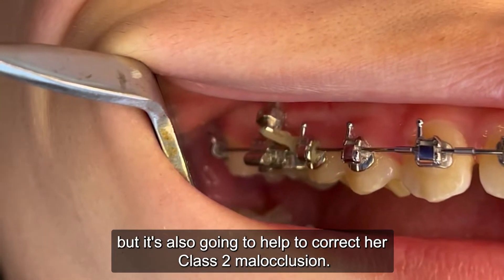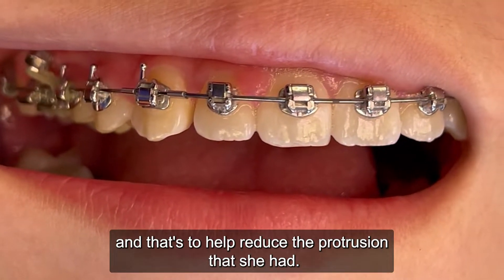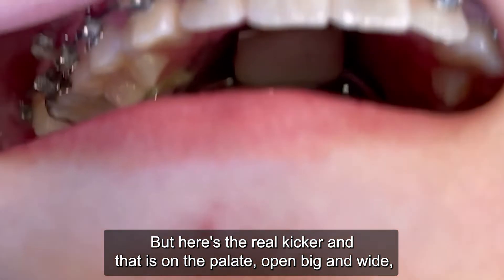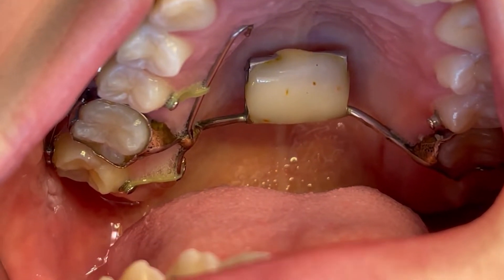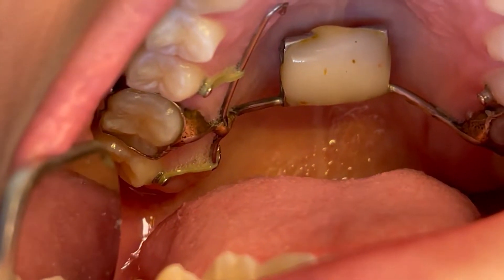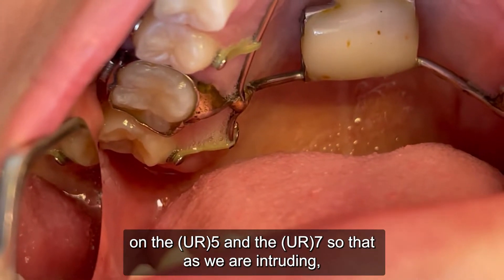You'll notice we've gone ahead and flipped the upper two-to-two brackets — that's to help reduce the protrusion she had. Now here's the real kicker: on the palate, what we have here is this expander combined with a TPA, and we have these little buttons on the 4 and the 7.